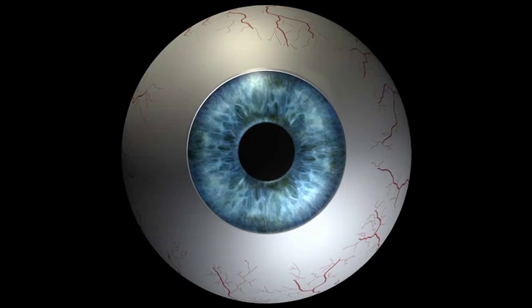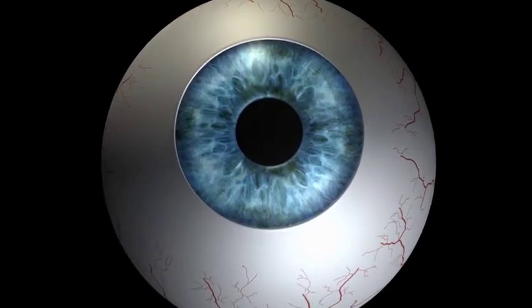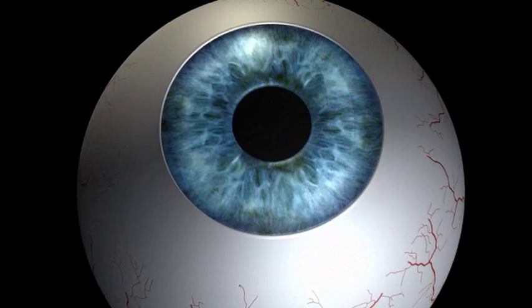The TransPRK is a transepithelial single-step treatment that avoids the eye coming into contact with any instrument.